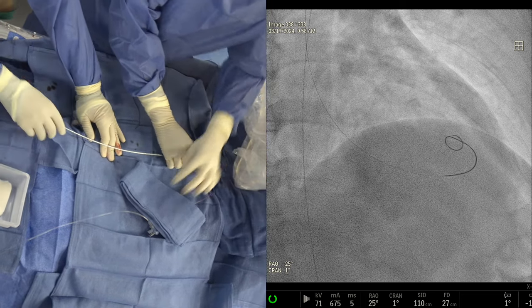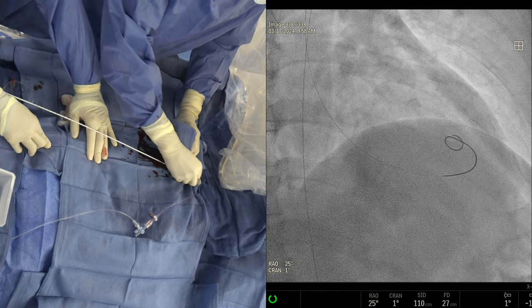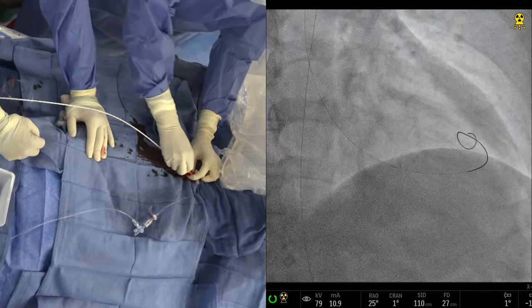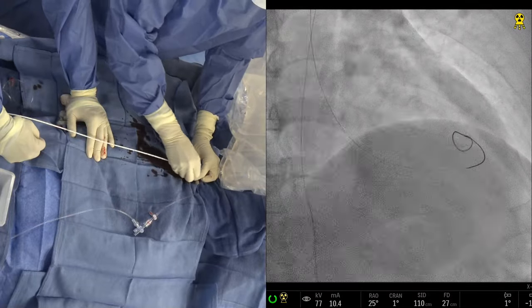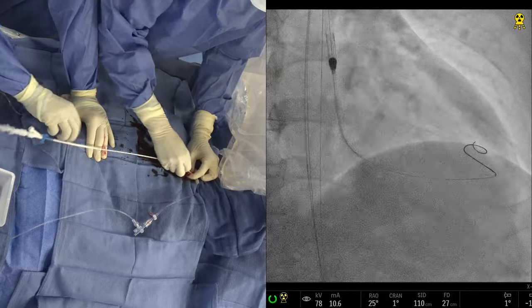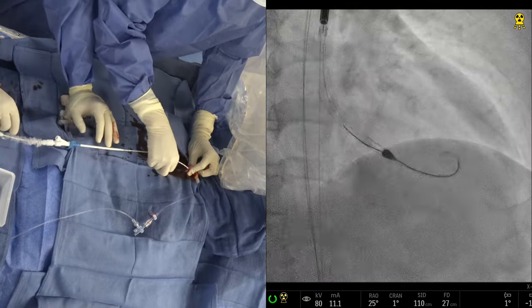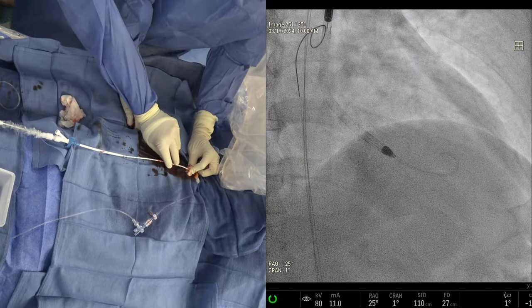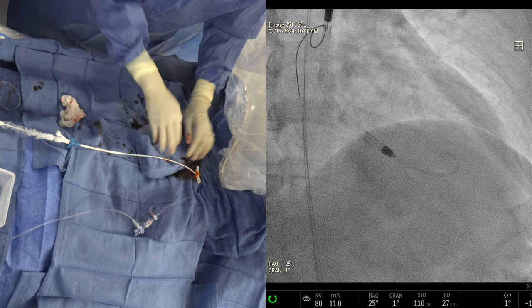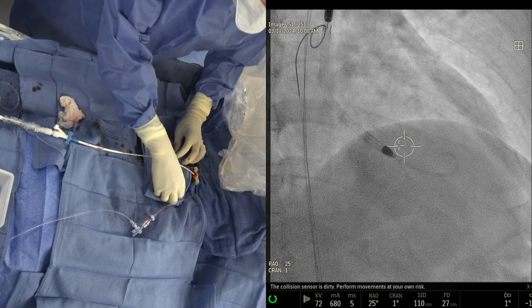Now we can see the Impella about to go in. It's going to bleed a little from the pump site with the insertion going fast. Many people want to go without the wire, but we have always gone with the wire — and you should use the wire. So now it will be sitting as a pigtail on short monorail, looks good. The tech will start. We have heparin and ACT is about 308.